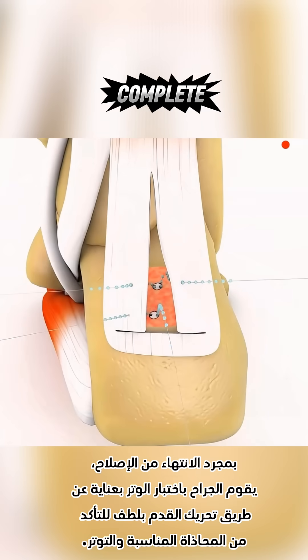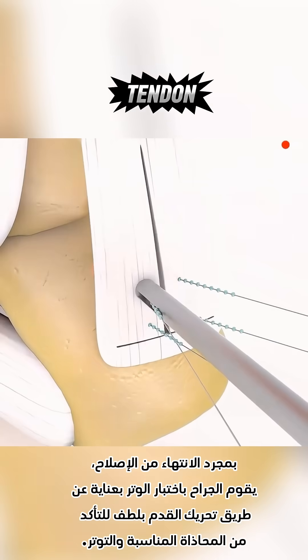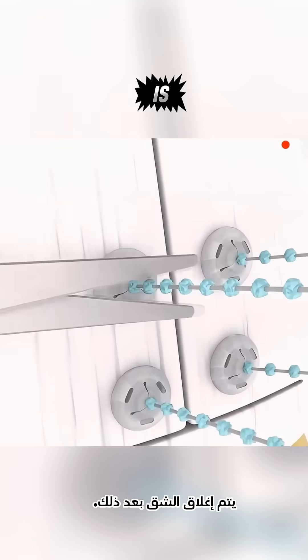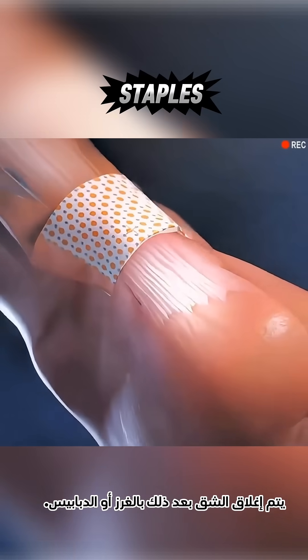Once the repair is complete, the surgeon carefully tests the tendon by gently moving the foot to confirm proper alignment and tension. The incision is then closed with sutures or staples.